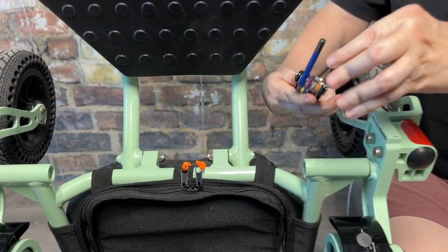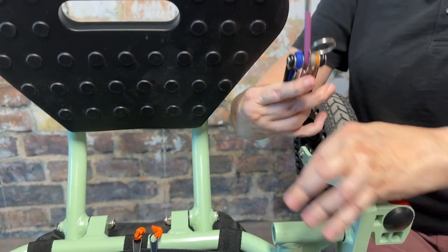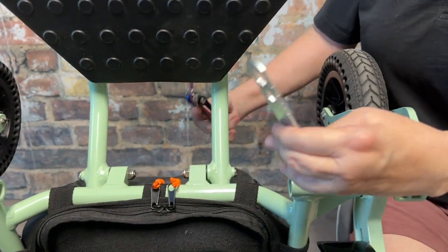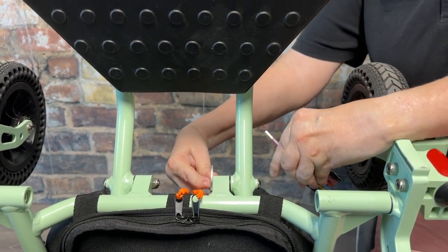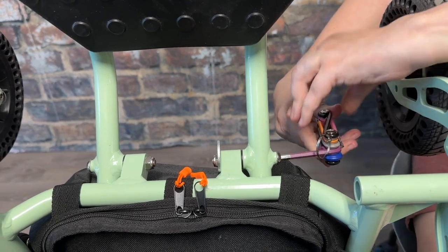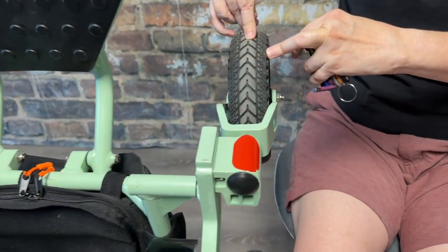Next you're going to tighten the footrest. Switch to the purple size allen head and grab your makeshift wrench. Line up the holes on the makeshift wrench that match the size of the nut. Take the purple hex head, tighten it, and do that for both sides.